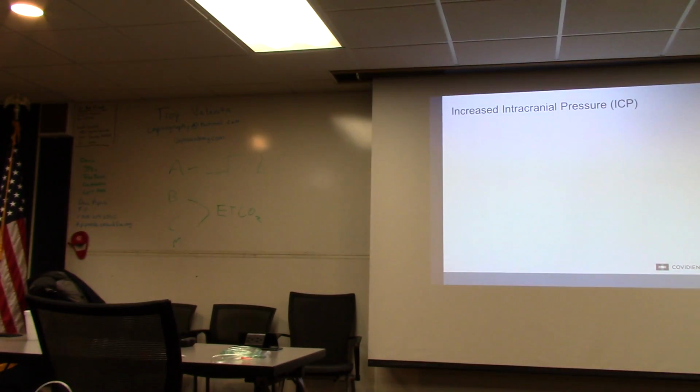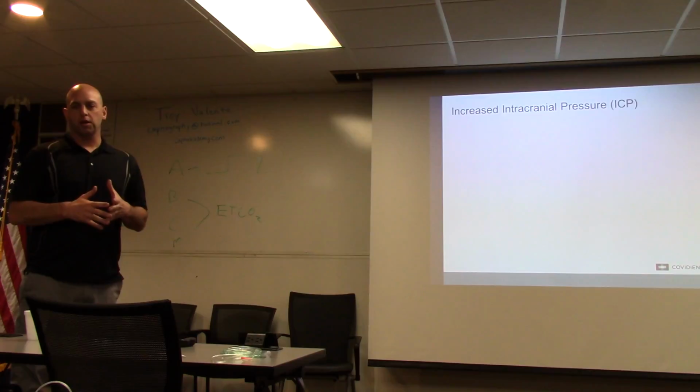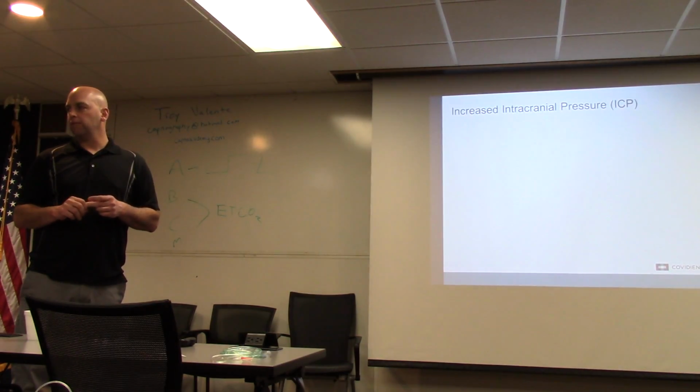Do we manipulate how we ventilate a patient in cardiac arrest to achieve a specific end tidal CO2? Or do we just keep it strong, keep it steady, and let the end tidal CO2 be whatever it is? What do you think? Option 2, we do not manipulate, we don't change. If we were to teach people, okay, if the end tidal CO2 is low in cardiac arrest, bag them slow and try and keep it between 35 and 45.